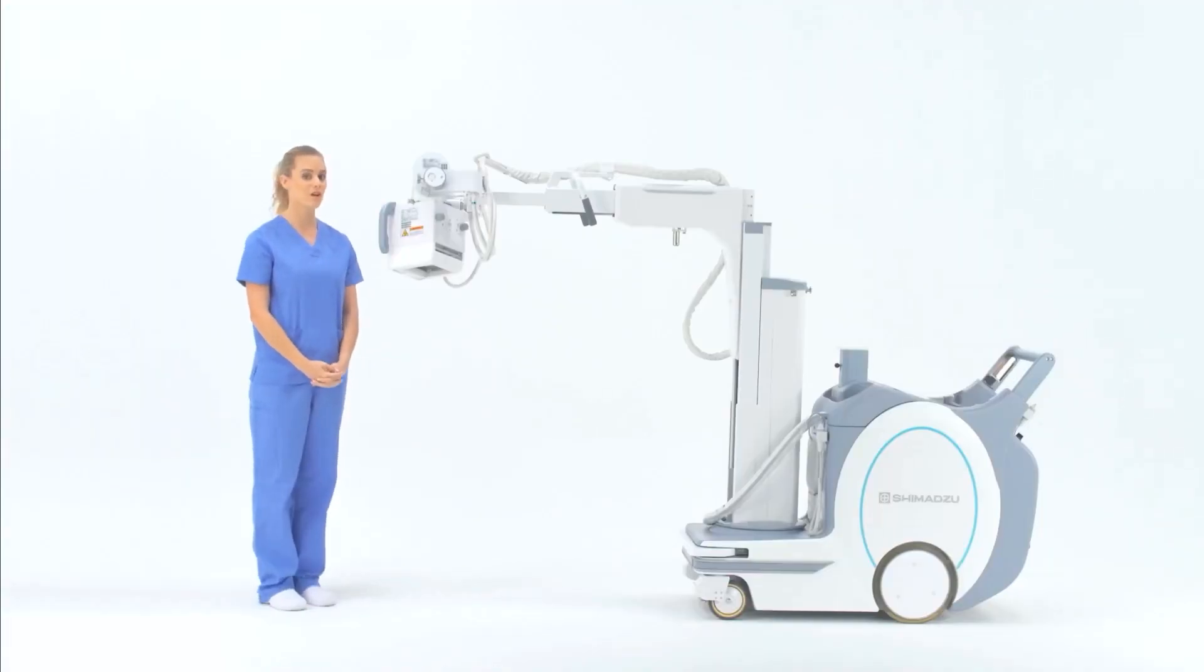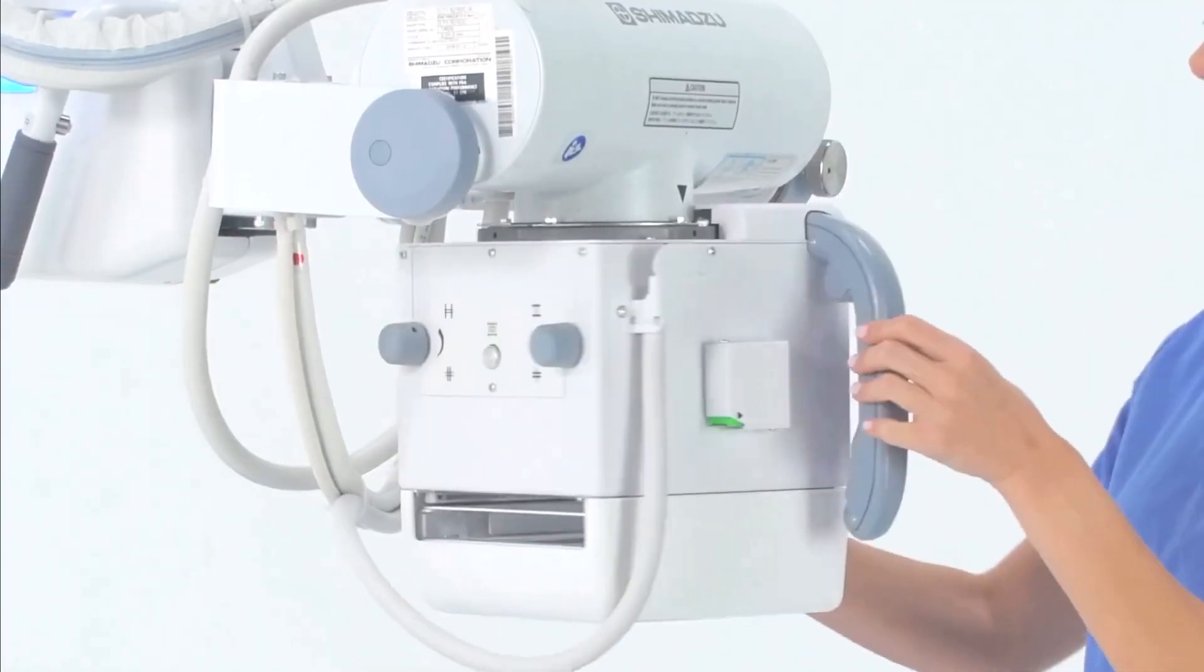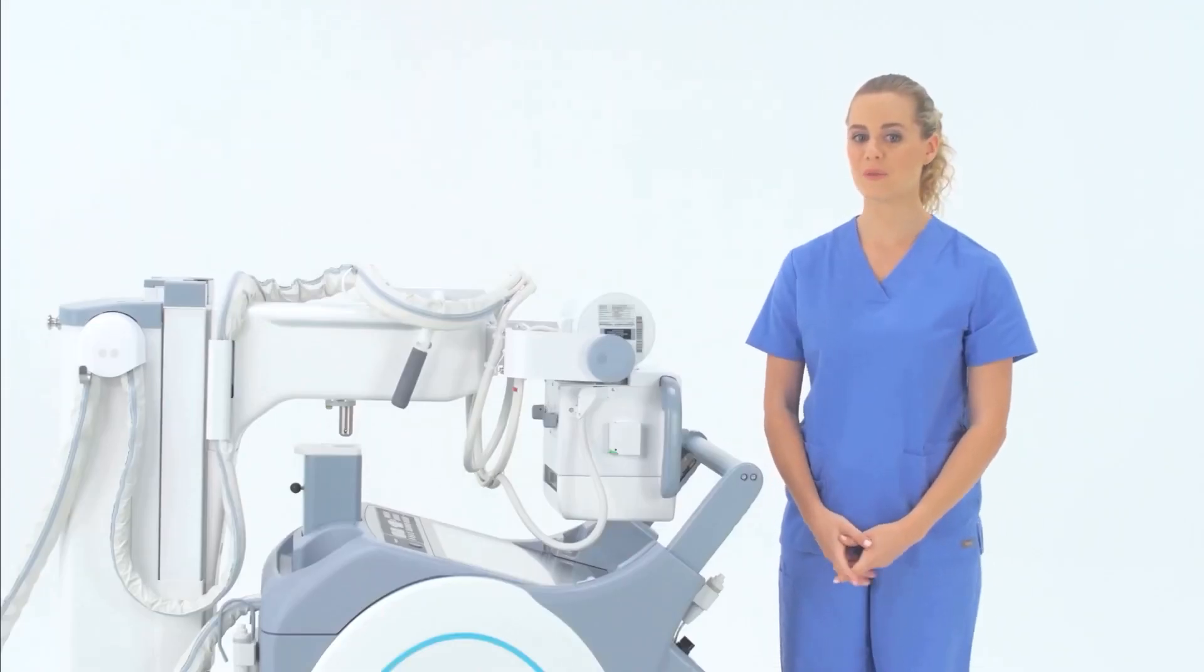If additional rotation of the collimator is required, this knob can be loosened to allow an extra point of articulation. The collimator can be tilted both ways.